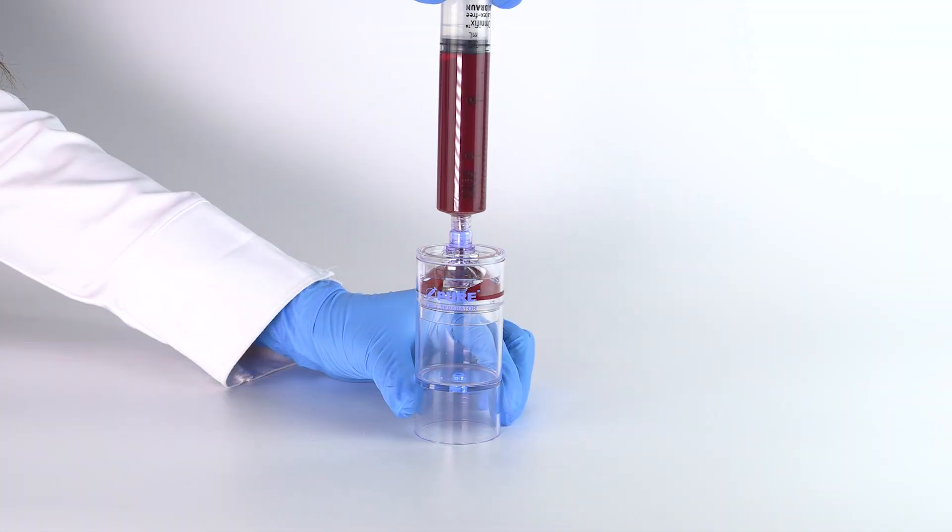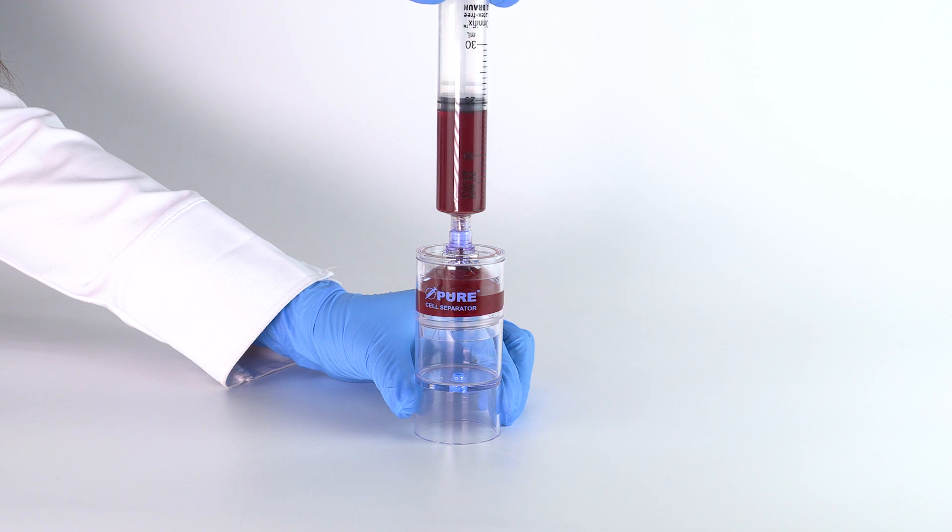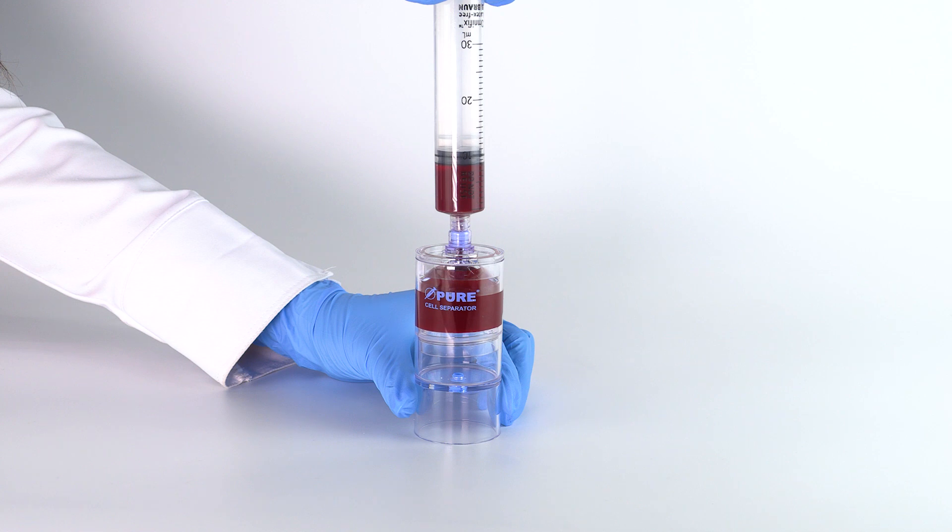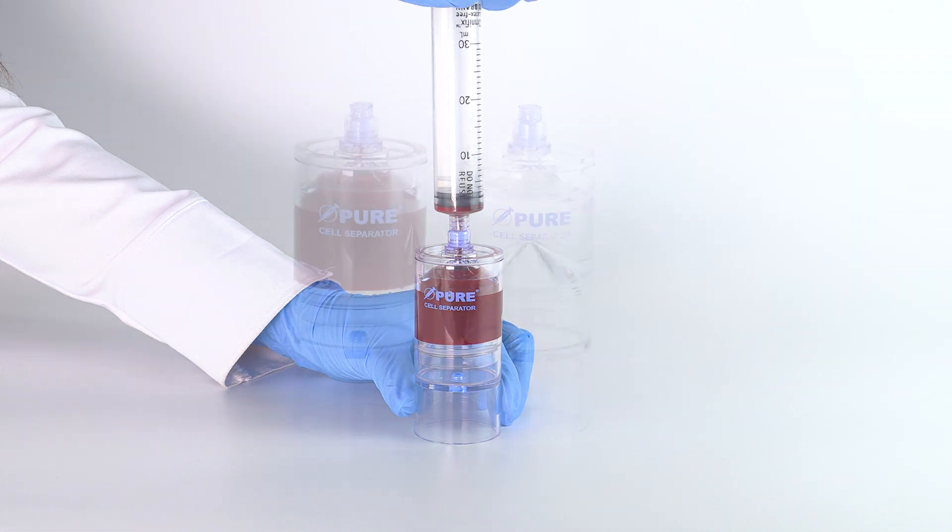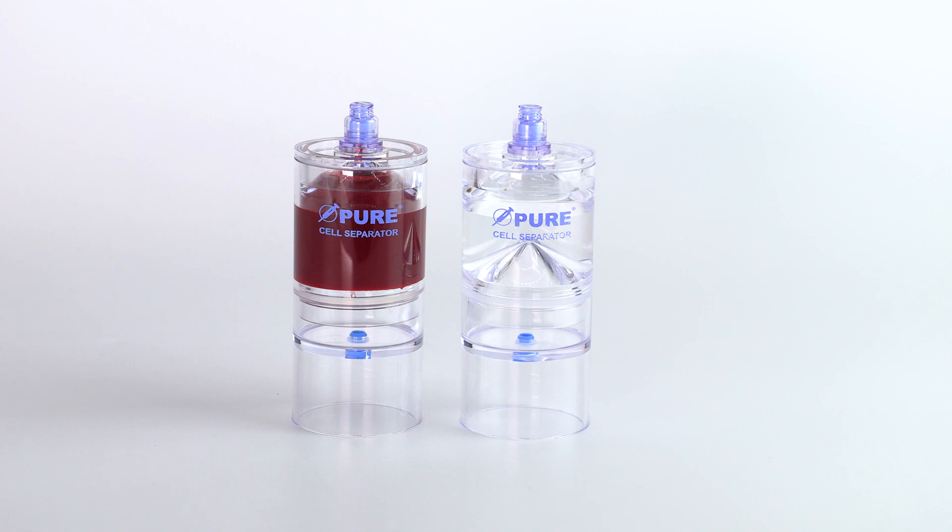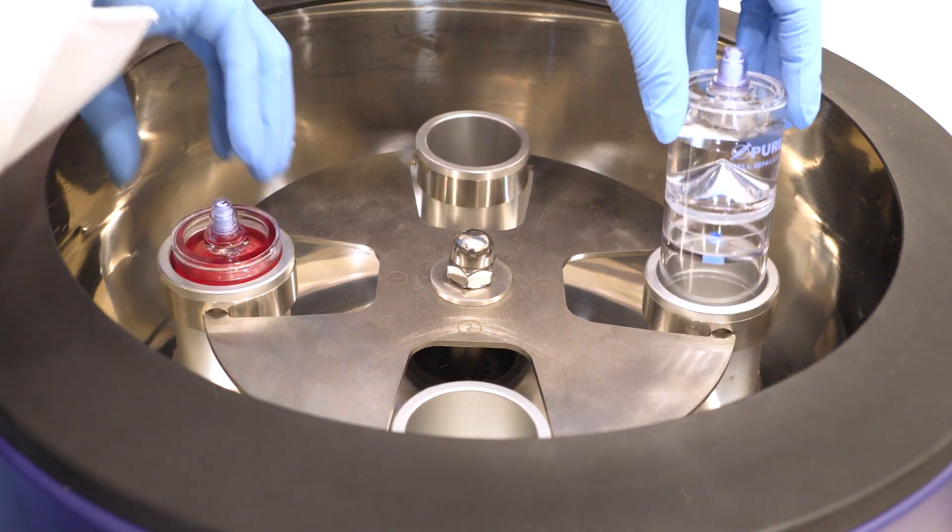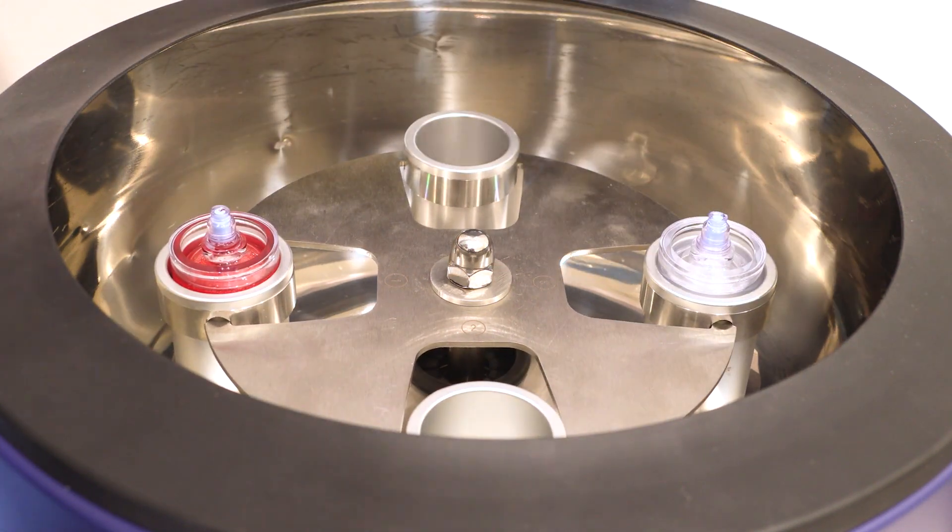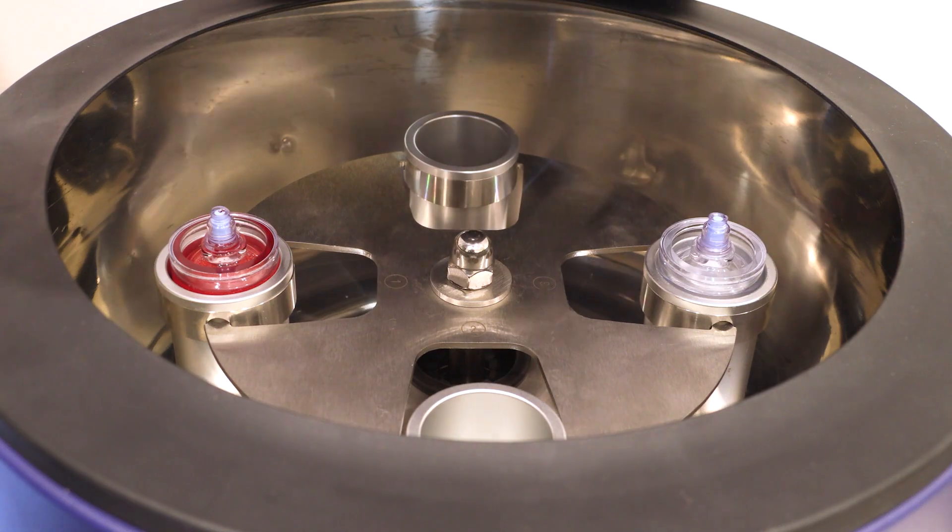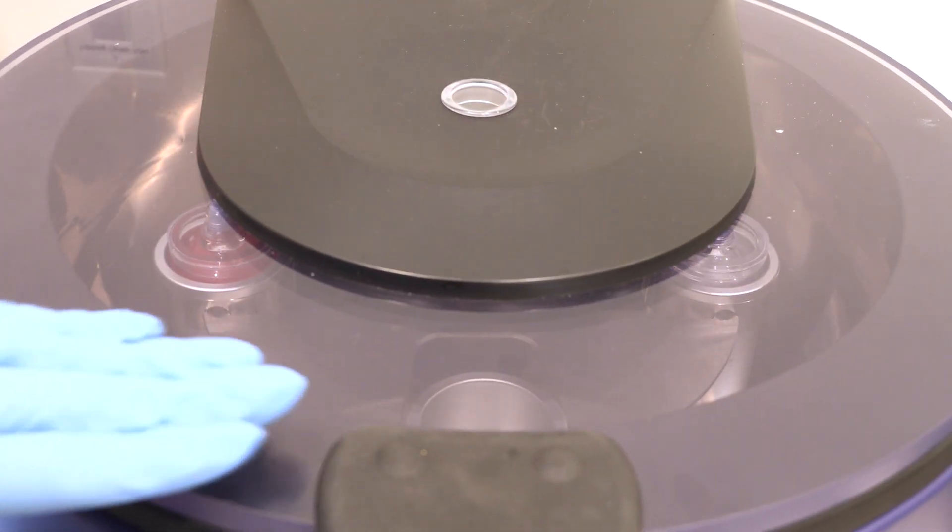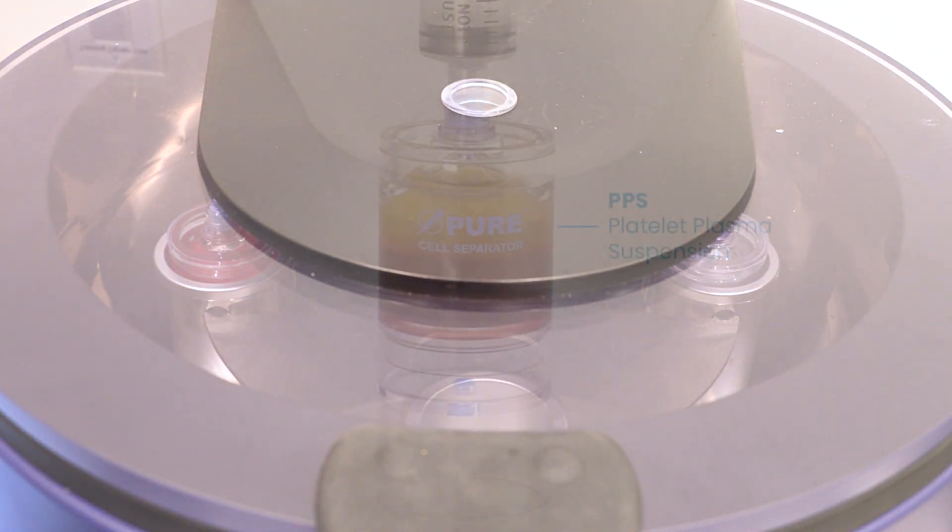Attach the 30 milliliter blood syringe to the needleless port of the separator device and slowly inject the anticoagulated blood. Use the counterbalance device to counterbalance with equal volume. Place both devices in the centrifuge rotor at opposite ends. Follow the protocol settings provided in the Pure 2 IFU insert. Close the centrifuge lid and press start.